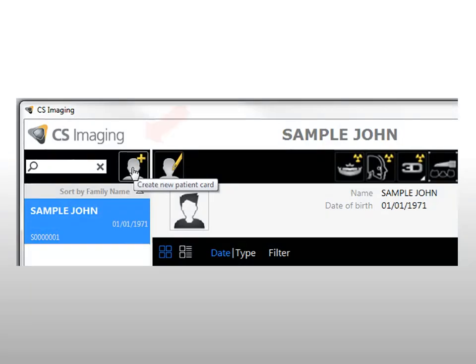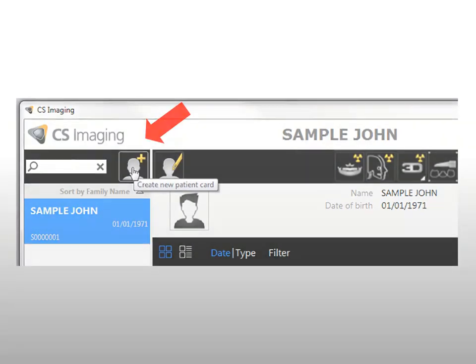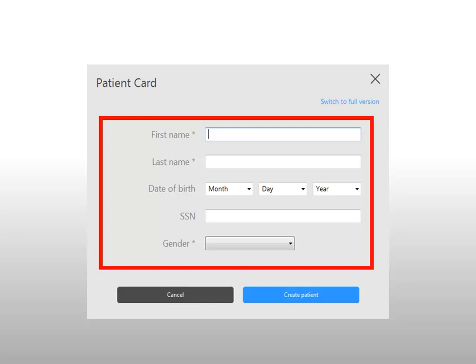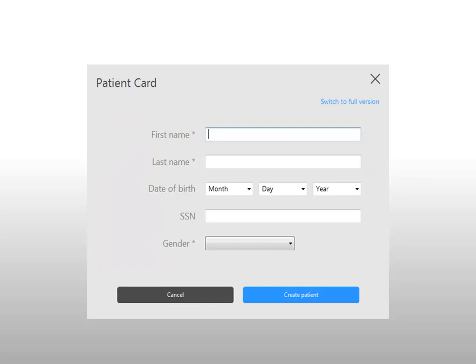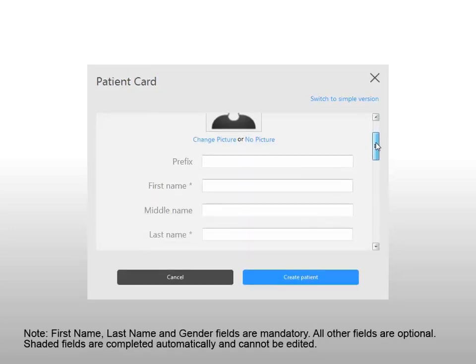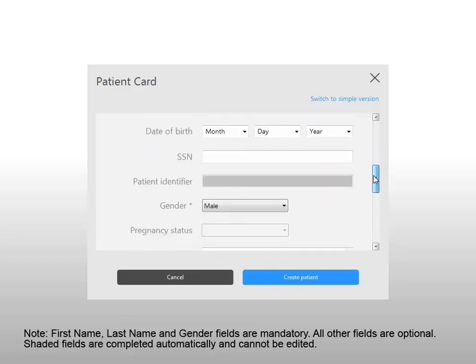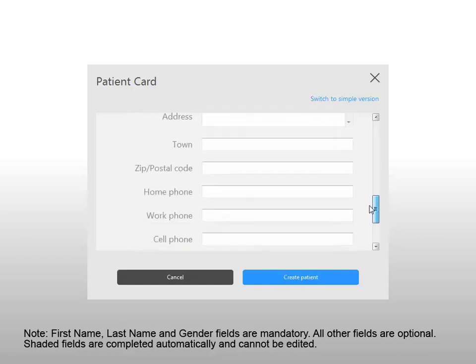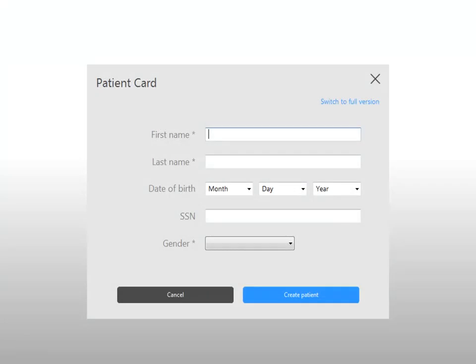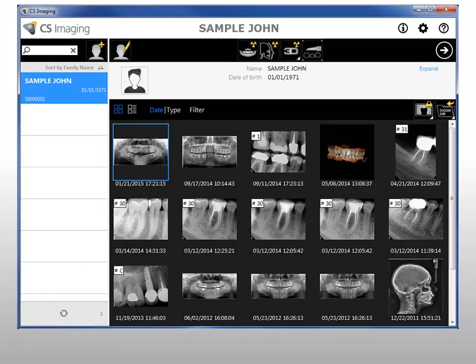Work with the patient card. To create a patient card, click Create a patient card. The patient card window is displayed. Enter patient information in the patient card window. If you need to enter additional patient information, click Switch to Full Version. First name, last name, and gender fields are mandatory. All other fields are optional. Shaded fields are completed automatically and cannot be edited. When you have finished entering data, click Create Patient. The patient card window closes and the new patient appears in the patient list.